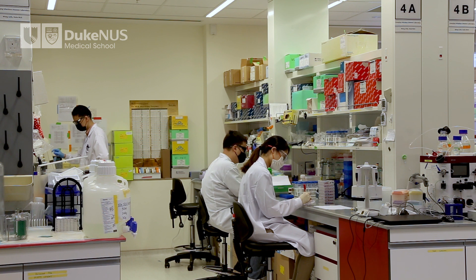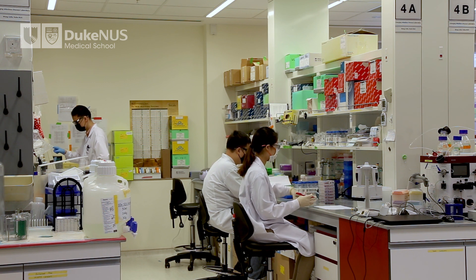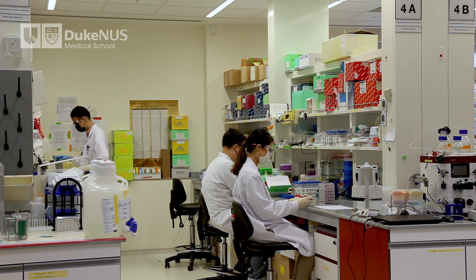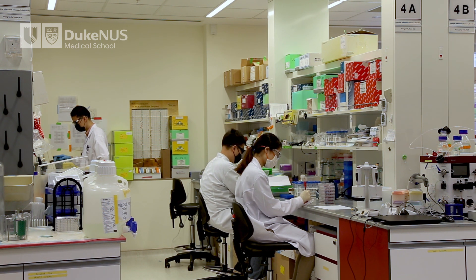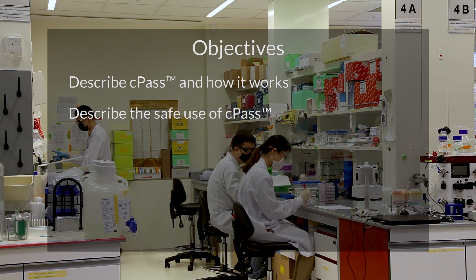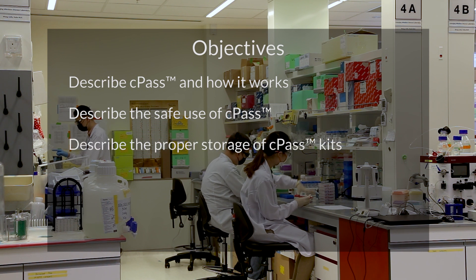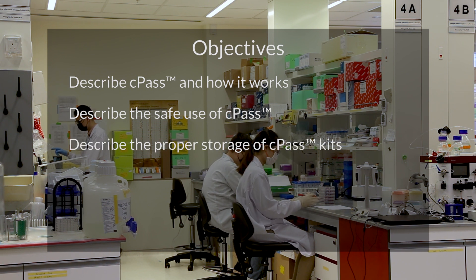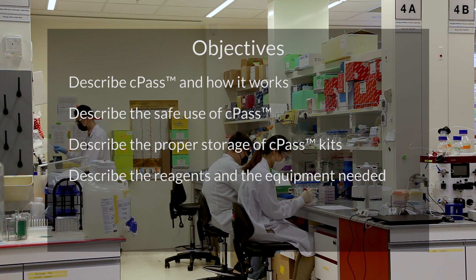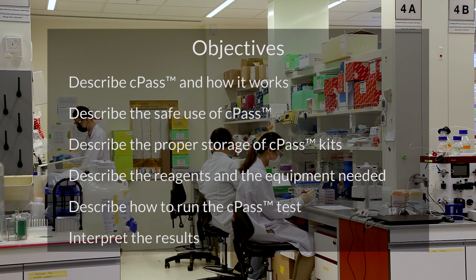This short video will show you how to run the SARS-CoV-2 Neutralization Antibody Detection Kit, or CPAS. At the end of this video, you should be able to: describe CPAS and how it works, describe the safe use of CPAS, describe the proper storage of CPAS kits, describe the reagents and equipment needed, and describe how to run the CPAS test and interpret the results.